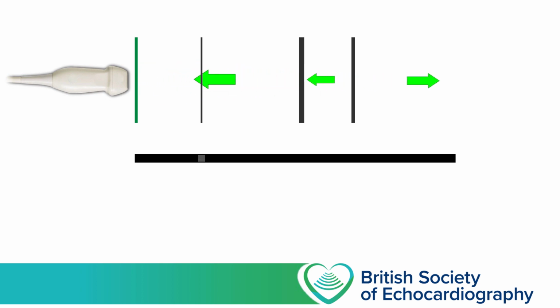So what information does the ultrasound software record? Well, it measures the amplitude of a returning wave, how much energy returns, and it also measures the amount of time it took for the energy to return following the transmission of the original wave. So the piezoelectric crystals are only transmitting energy for a tiny fraction of the total cycle time. For the remainder of the time they're listening. They're waiting to be struck by returning kinetic energy, convert that into an electrical signal and send it to the ultrasound machine to be interpreted.